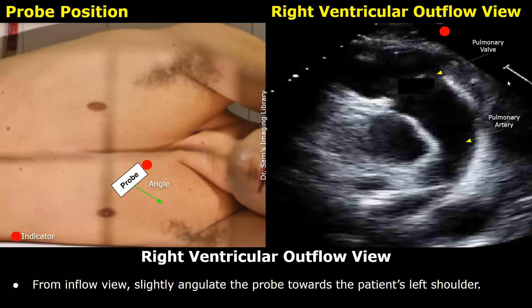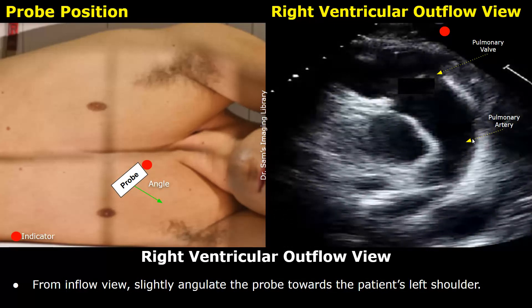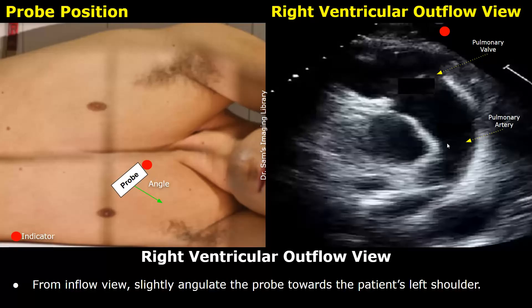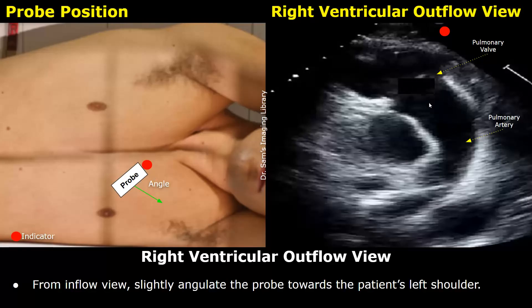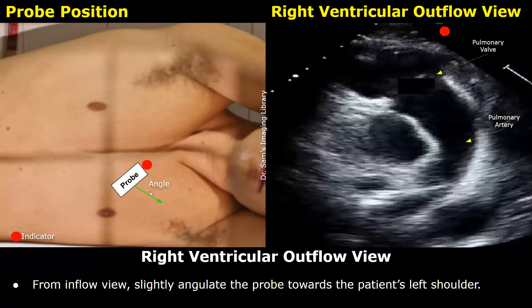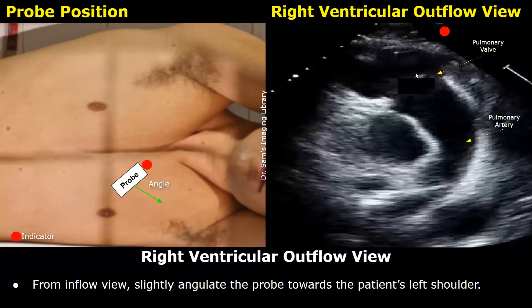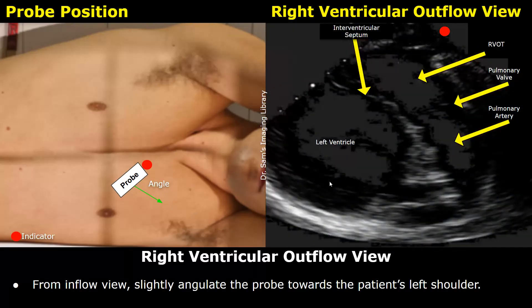The next view is the right ventricular outflow view, which provides a good view of the pulmonary artery and pulmonary valve. To get this view, slightly angulate the probe towards the patient's left shoulder. With some angulation adjustments, you should also be able to see the left ventricle and part of the interventricular septum.